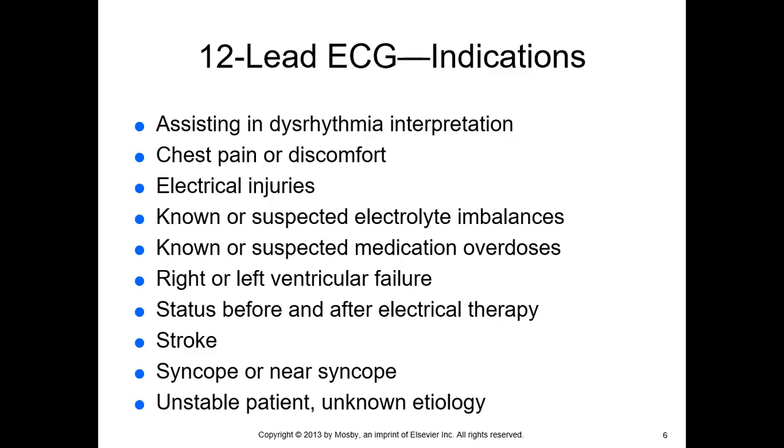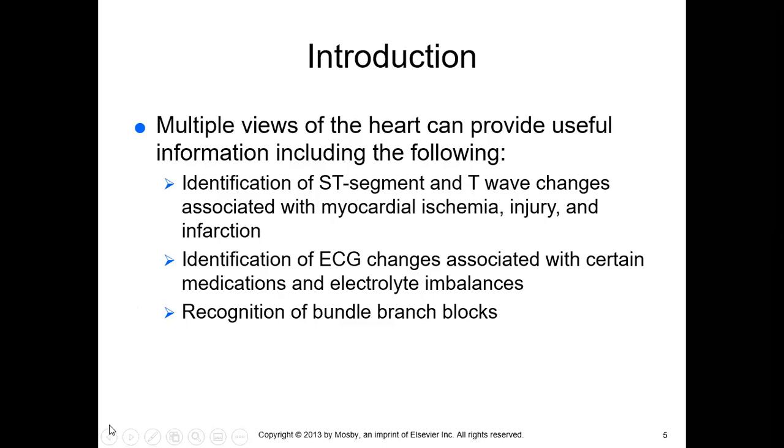So some indication for, actually, I would like to go back one. A standard 12 lead EKG provides a view of the heart in both the frontal and horizontal plane and views the surface of the left ventricle. This is the basic view from 12 different angles. That's why it's called 12 lead EKG. You need 12 leads to look at all the different angles.